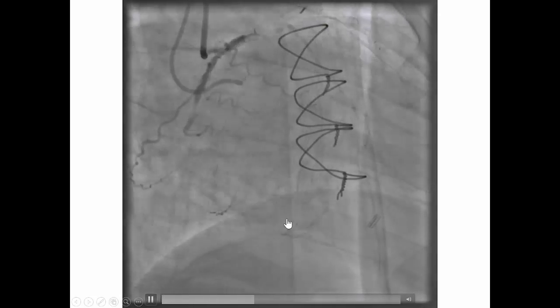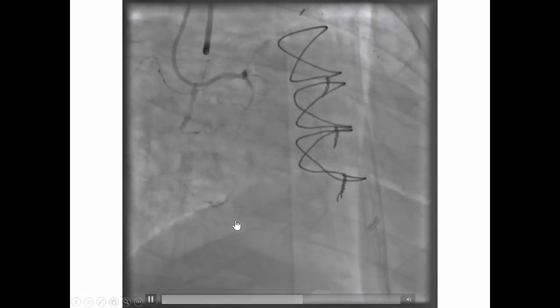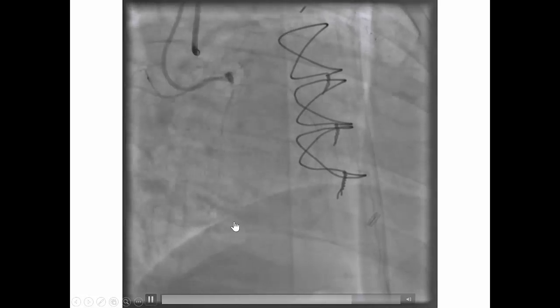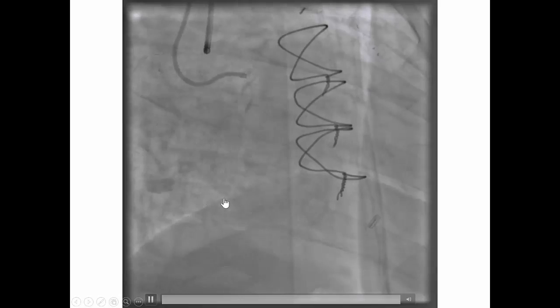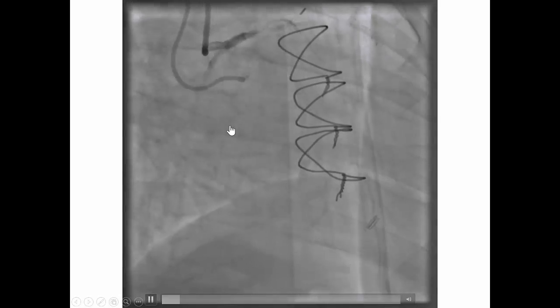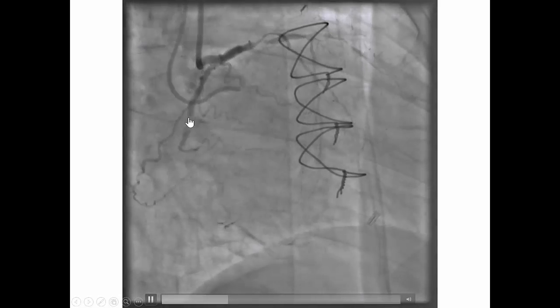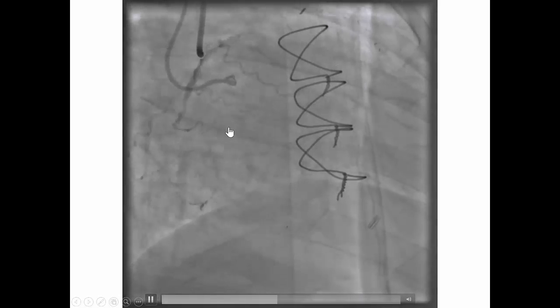There are some septal collaterals feeding the PDA, which is important to know in case retrograde crossing is needed. In this particular case, we decided to first try antegrade wire escalation.